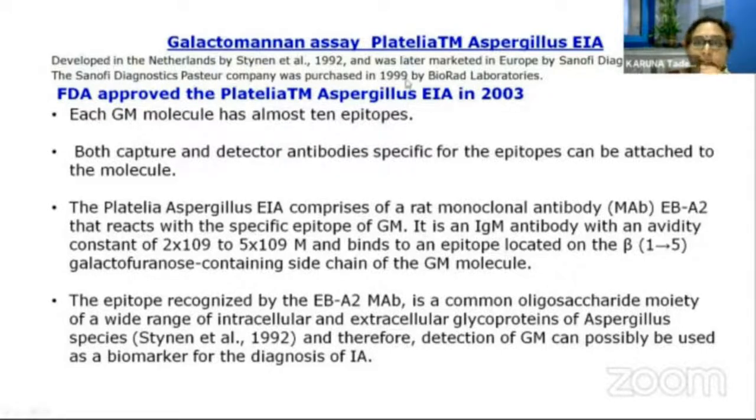And this galactomannan assay of Platelia was developed in the Netherlands and was marketed in Europe by Sanofi Diagnostics. And slowly it was purchased by Bio-Rad Laboratories. So this is the only FDA-approved one, the Platelia Aspergillus enzyme immunoassay.